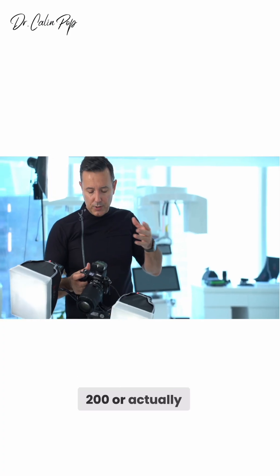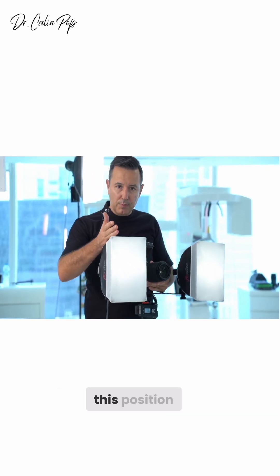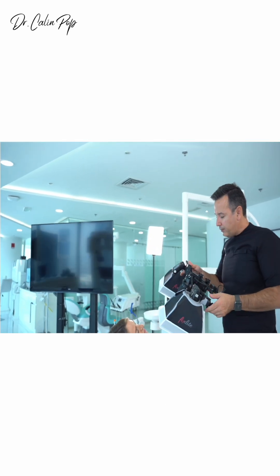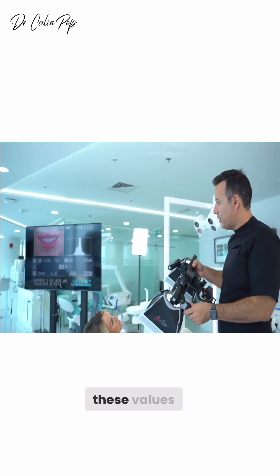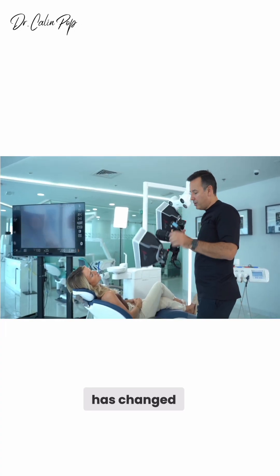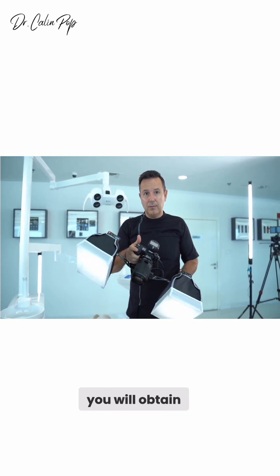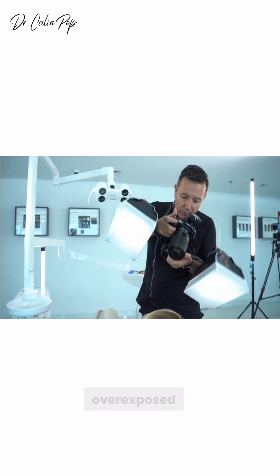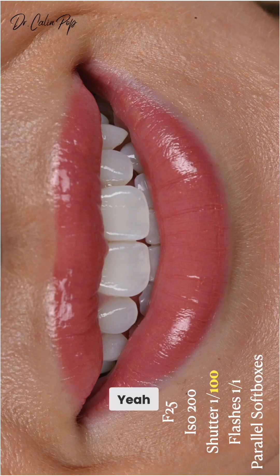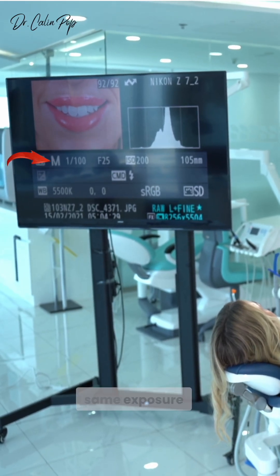Shutter speed 1/200, f25, ISO 200, flashes on maximum power — this position of the softboxes and the distance that we have talked about gives proper exposure with these values. Now let's make the shutter speed slower: shutter 1/100, nothing else has changed. Obviously we expect a slower shutter speed to give more exposure and an overexposed photo — but the photo is the same. Comparing with the previous photo at 1/200 and 1/100: same exposure.